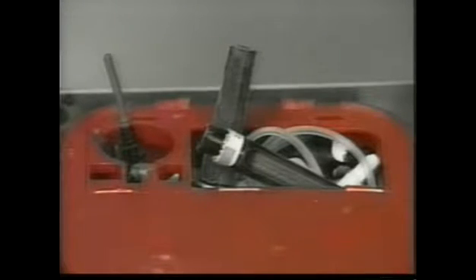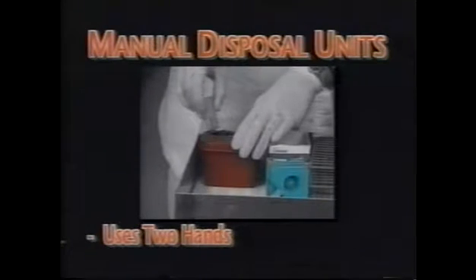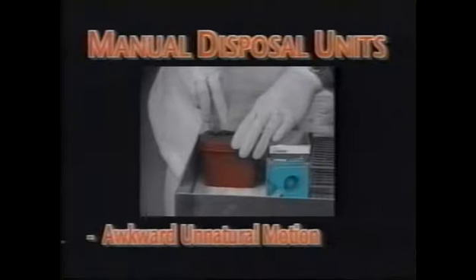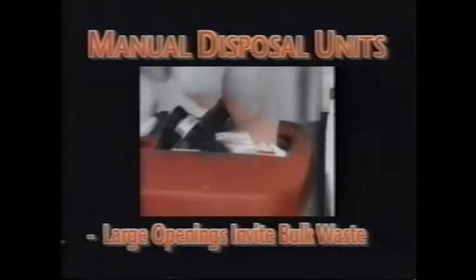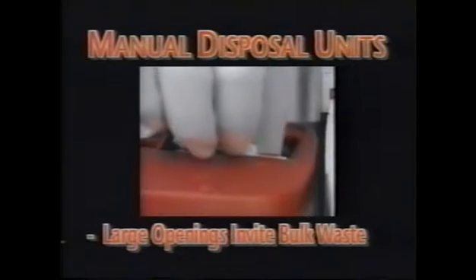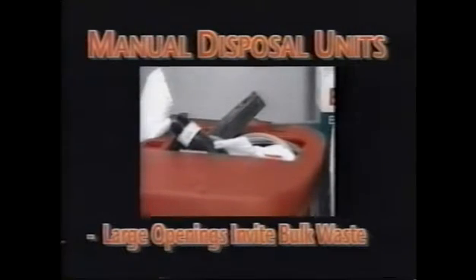These manual methods cause several problems. The outdated manual method requires the use of two hands, performing an awkward, unnatural motion. Additionally, the large openings in these containers invite the disposal of bulk waste materials like cotton, gauze, and needle caps. All too often, this foreign material hides upturned needles, resulting in accidental needle sticks.